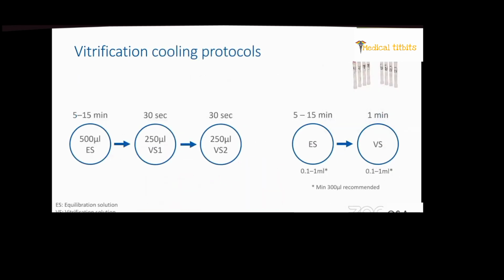Though they may appear different, most commercial vitrification kits have similar composition and protocols. Vitrification is a simple two-step procedure that requires the movement of cells from a cryoprotectant equilibration solution to a more concentrated vitrification solution. Here are two examples of popular protocols used successfully for embryos.